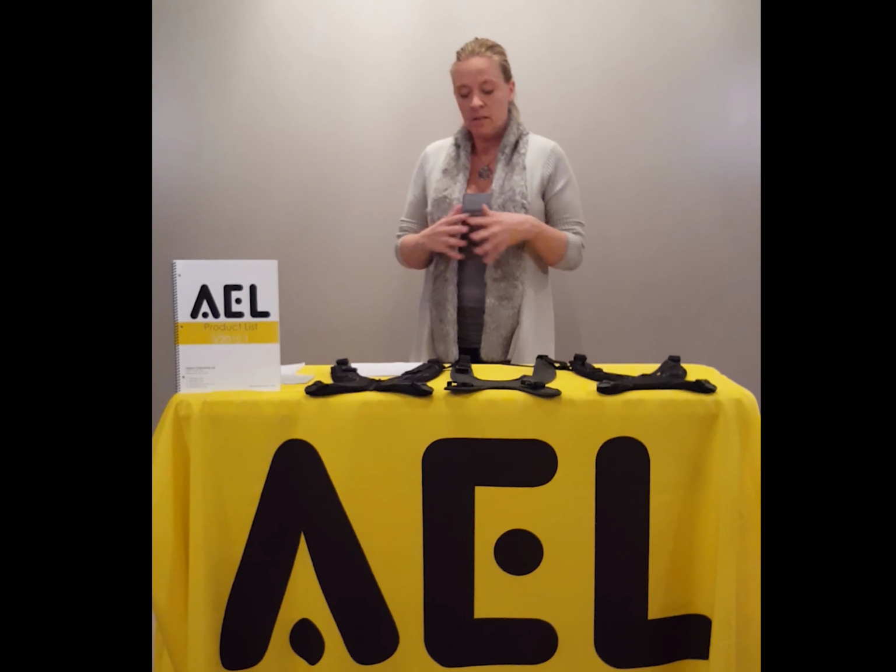The other thing to think about with the stretch option is that sometimes, as a clinician, you would like a client to be able to reposition and move around within that seating system just a little bit.